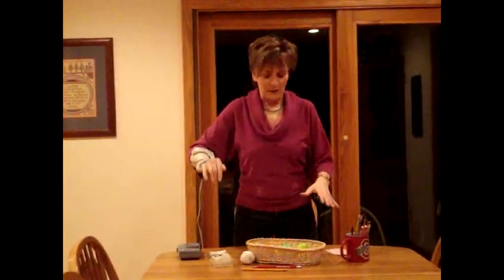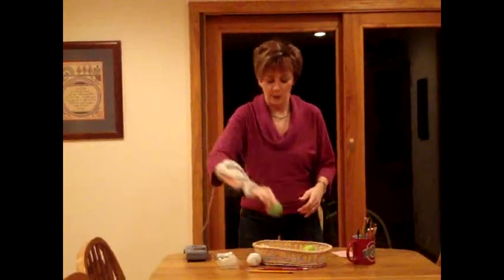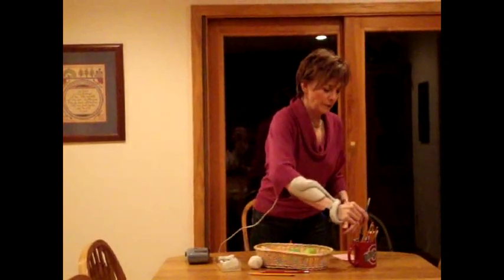So I did this, and when it opened my hand up, I watched it and I said out loud, I'm opening up my hand, I'm picking up the ball, I'm putting the ball down. I'm opening up my hand, I'm picking up the pencil, I'm putting the pencil in the cup, or whatever it was that I was doing. After I did these objects, and it's amazing how, as we know, how tired your muscles get, I did light objects at first.